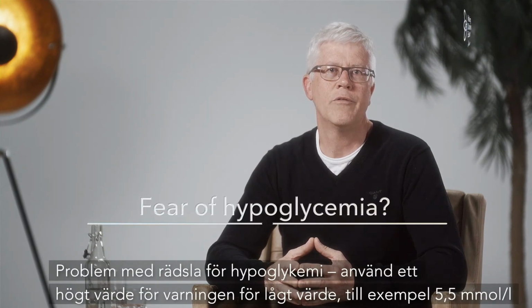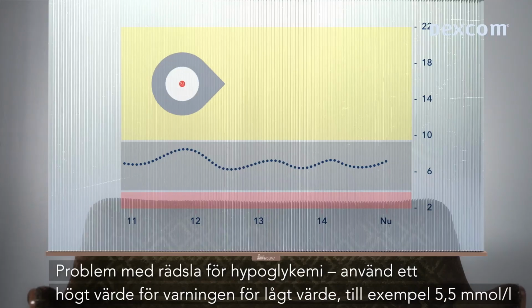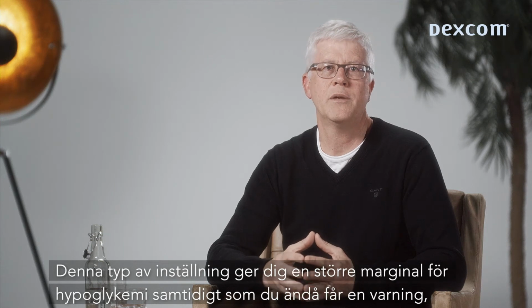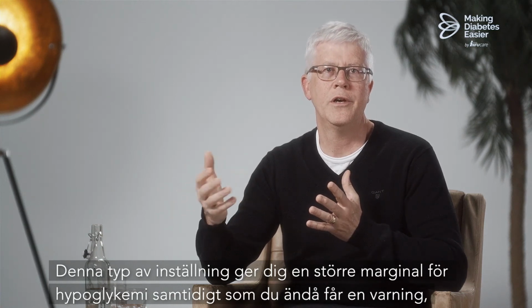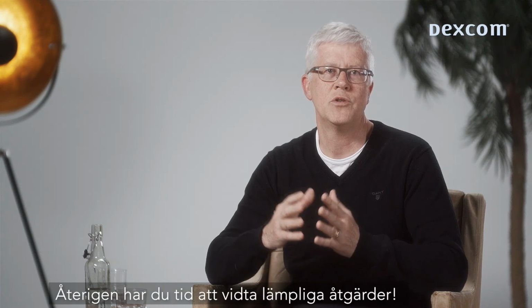Problems with fear of hypoglycemia. Then use a high level of the low alert, for example 5.5, along with a single arrow down. In time, when you feel safer and your glucose control might be improved, lower the low alert step by step. This kind of setting will provide you with a larger margin to hypoglycemia and at the same time still an alert that is activated if your glucose values tend to decrease anyway. Again, you have time to take some suitable actions.